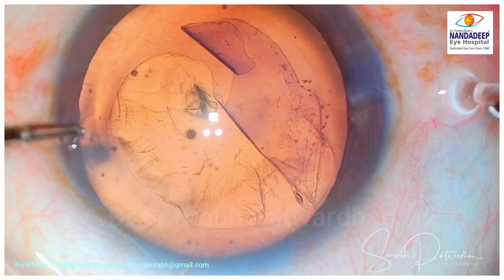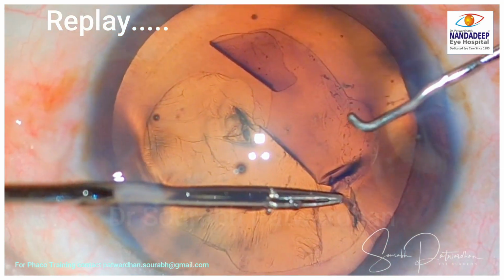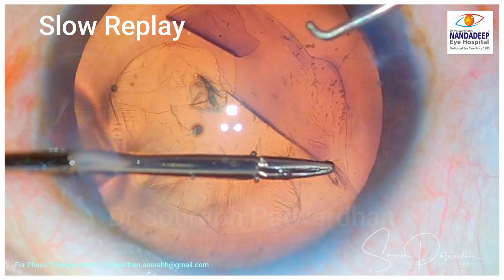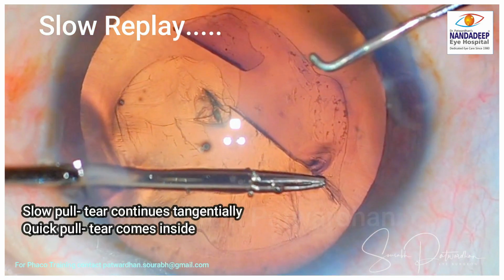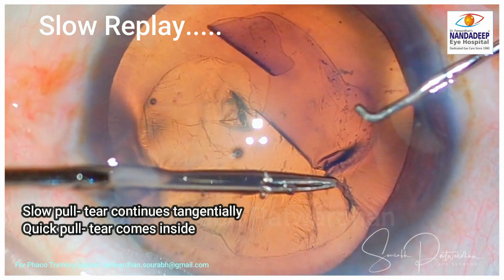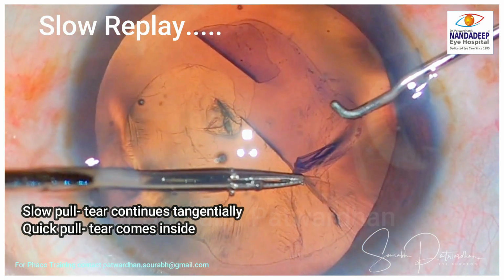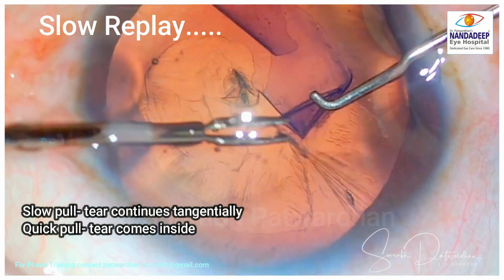We'll see again how the quick pull is must. Quick pull will balance the zonular force in a much better way. As you can see here, if you try to pull this very gradually, again the tear still continues to go tangentially out, and with quick pull the tear comes inside. You can watch this closely. As the surgeon pulls it more swiftly, the tear comes inside.